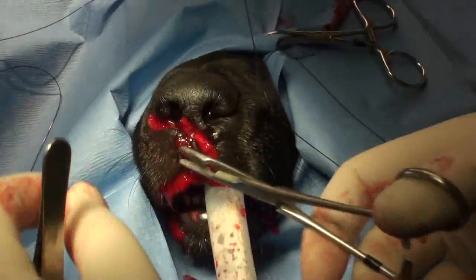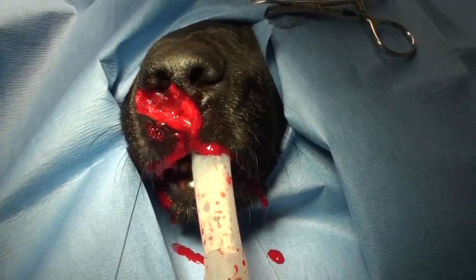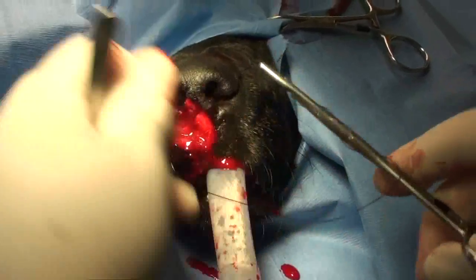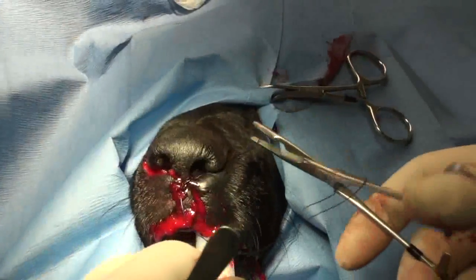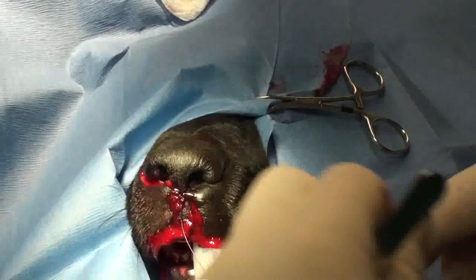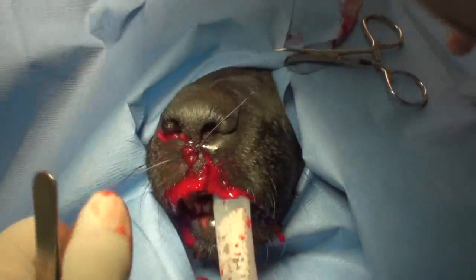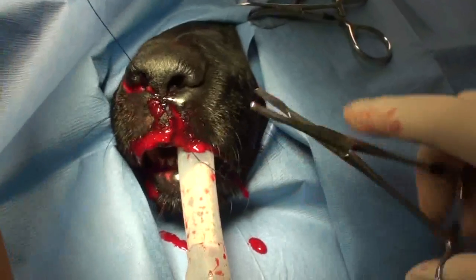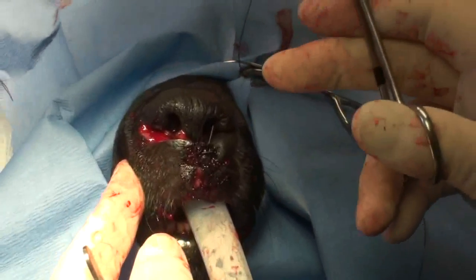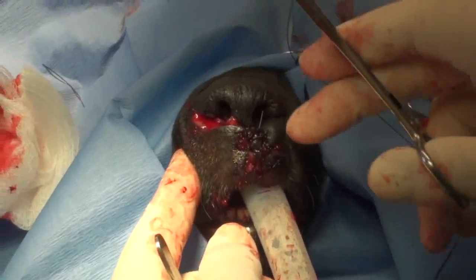See, that looks pretty good. It's a little bit of artwork sometimes — it's kind of fun. I want to turn a Picasso into a normal living, breathing thing. Right now it's like the nose is in a different place, but once you get this set, it starts to look better. Except for this nostril — it's a little pinched, but you can't have everything. So we have half done and now we're going to do this side and see if we can continue closing out.